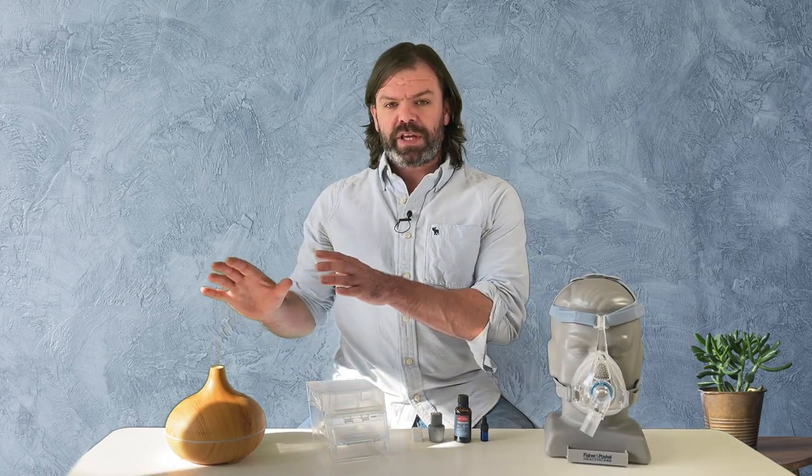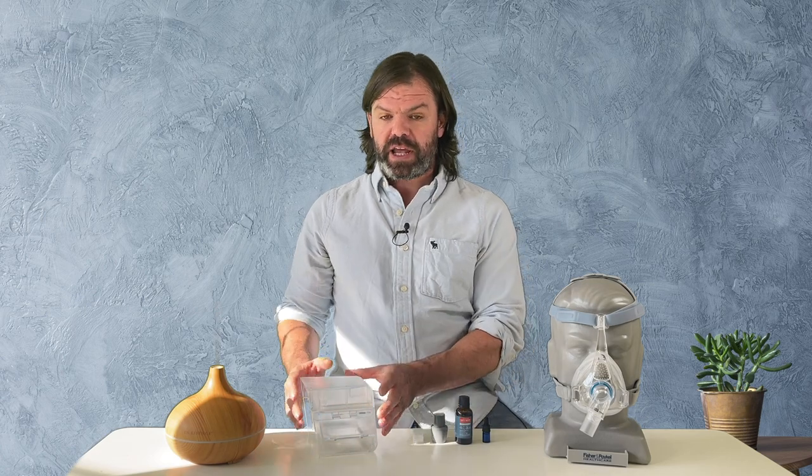Now, some of you might use one of these essential oil burners at home. A question I get frequently asked is, can you use your essential oils and put them in your humidification chamber? Let's say you've got a bit of a cold, maybe some sinus stuff going on, and you want to put a little bit of eucalyptus oil in your humidification chamber just to open up your airways a little bit. The answer is unfortunately no — your humidification chamber is just designed for water, no essential oils.